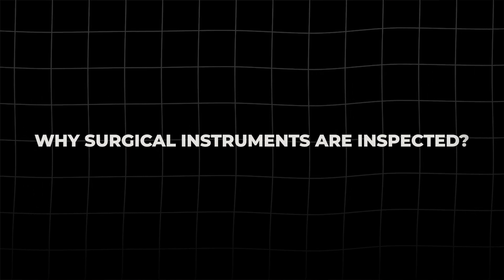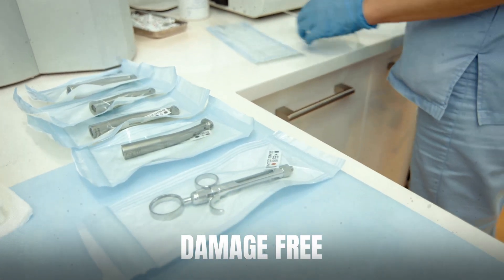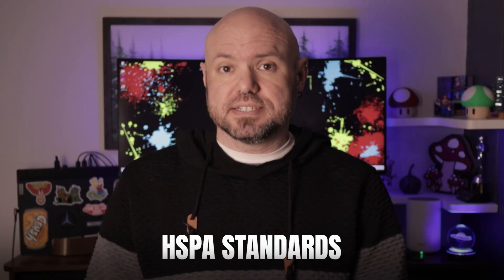First, let's talk about why surgical instruments are inspected. The inspection process is critical for ensuring instruments are clean, functional, and free from damage before they're sterilized and used on a patient. It's all about patient safety, efficiency in the OR, and compliance with AAMI, AORN, CDC, and HSPA standards.